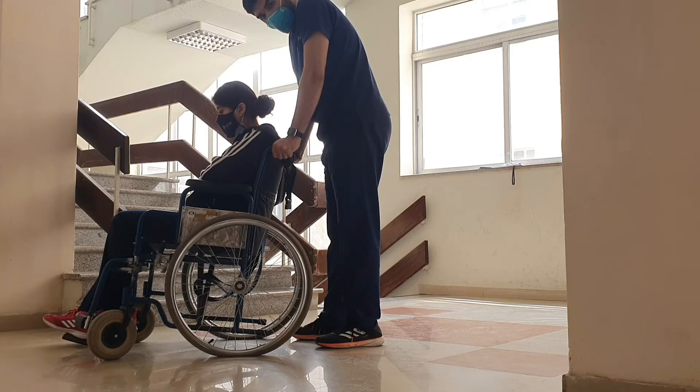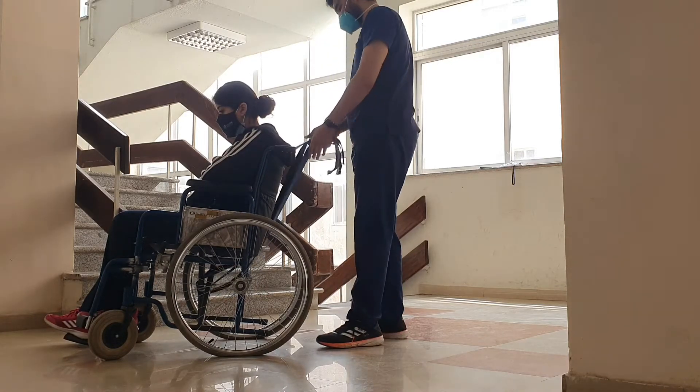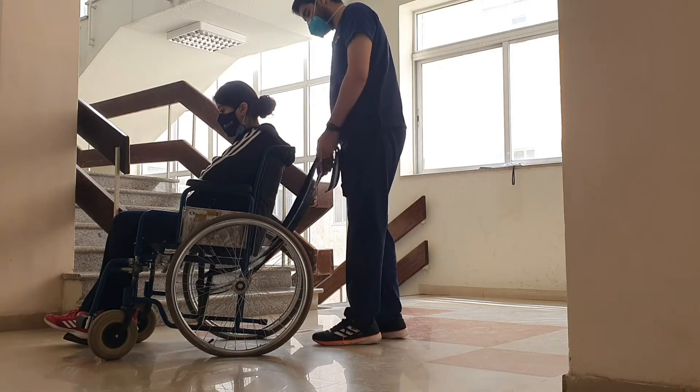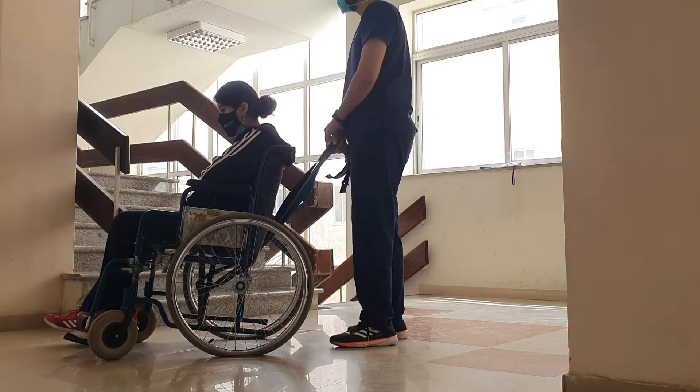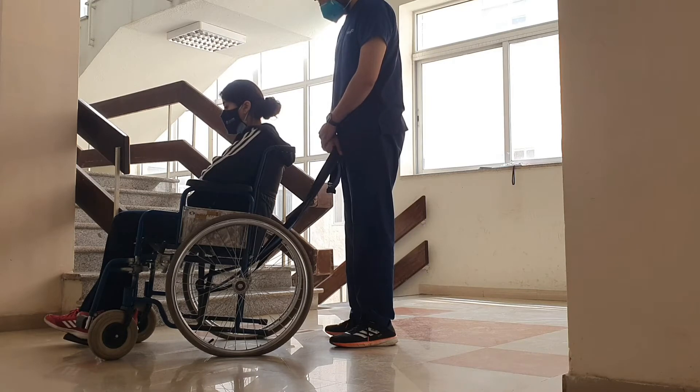The person needs to really practice the technique in order to master it. Basically, the person sitting on the wheelchair will lean backwards and propel forward, attempting to lift the casters off the ground.